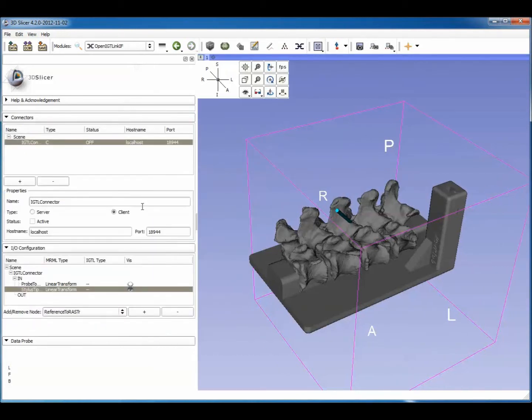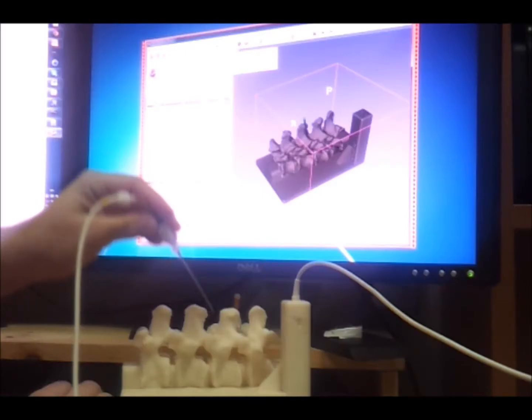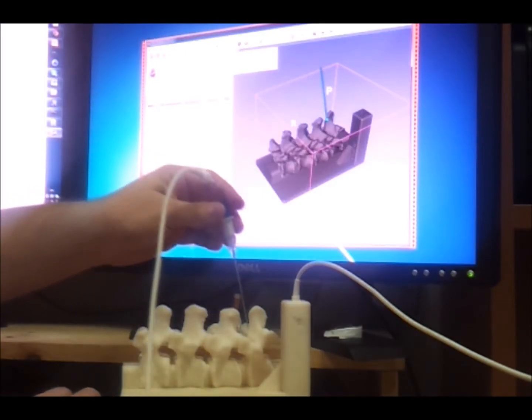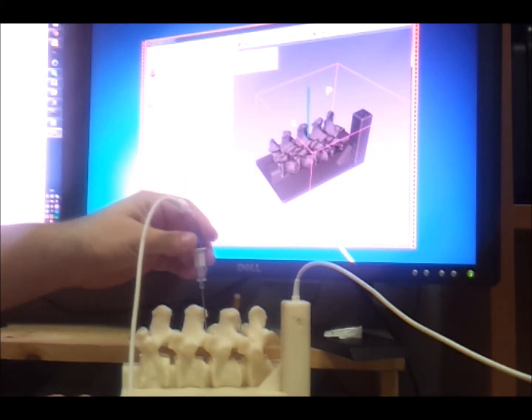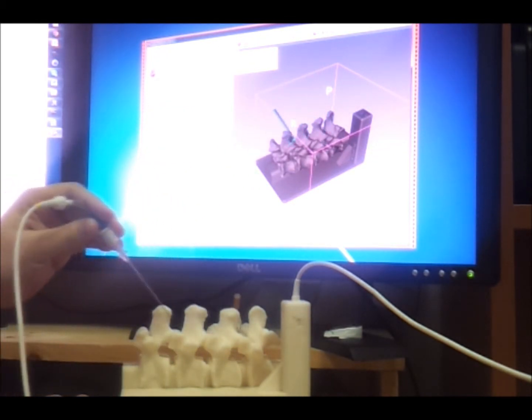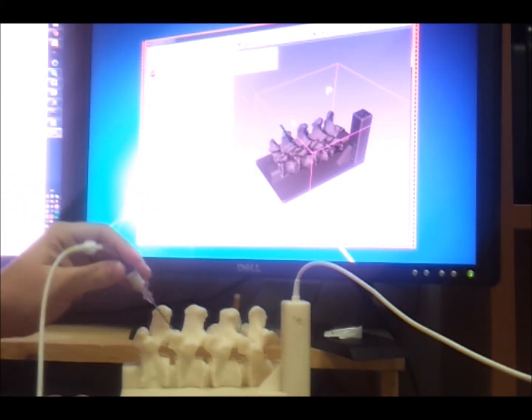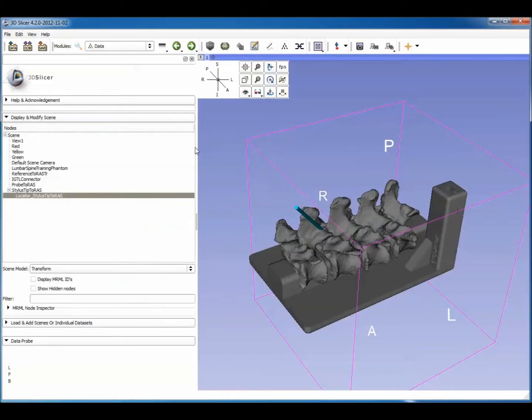First, we start tracking by activating the OpenIGT-Link connection. At this time, you see the stick representing the needle starts moving. This is classical needle tracking, and the tracking coordinate system is registered to the model in Slicer.